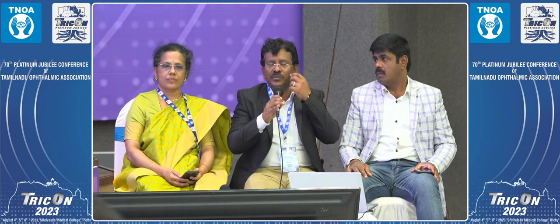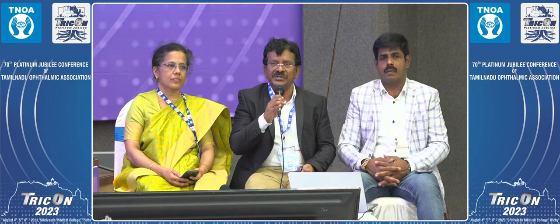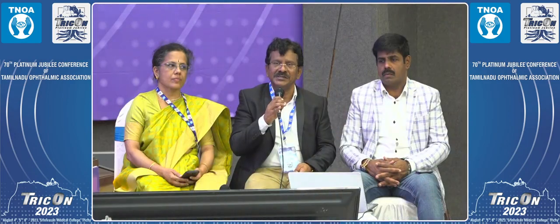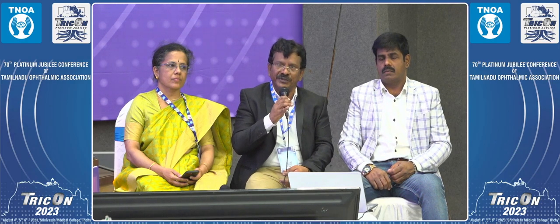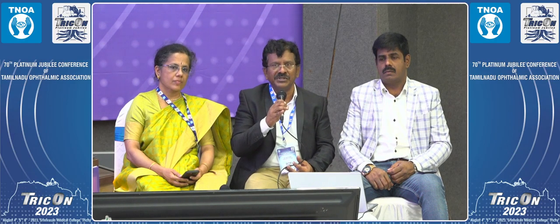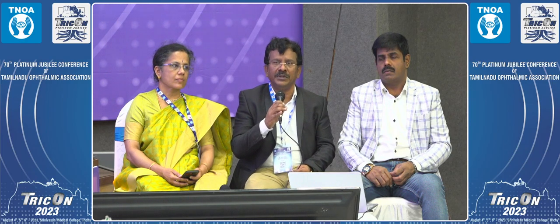Thank you. I think the most important thing is removal of the OVDs and what it can lead to. Very commonly, we see post-operative uveitis, and crystallization over the anterior surface of the IOL. So it's a take-home message for all the postgraduates to completely remove all the viscoelastic substance within the anterior chamber. Thank you.